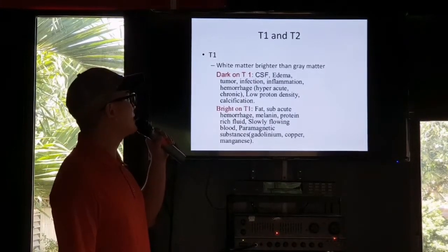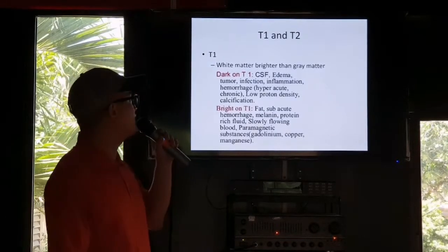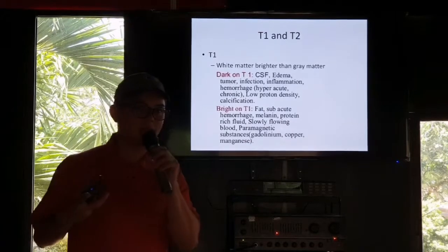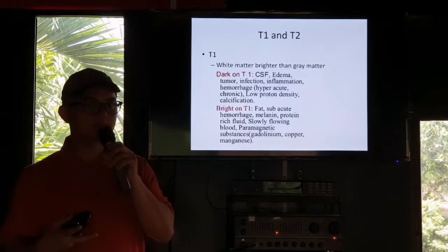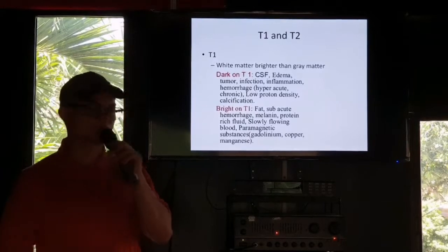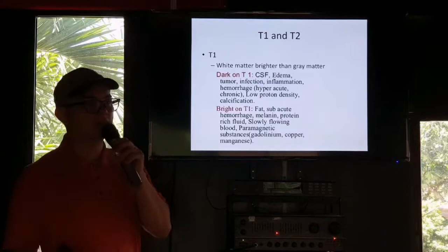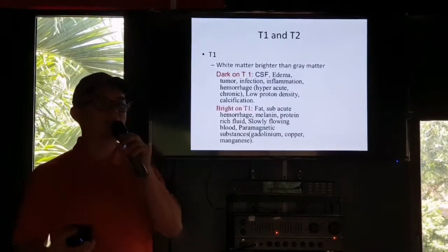On T1, of course, white matter is brighter than gray matter. So how do you remember this? T1 produces a better image of fat. More detailed image of fat.